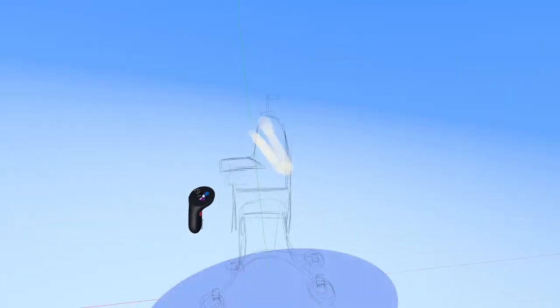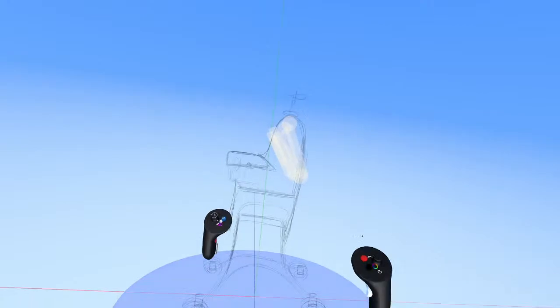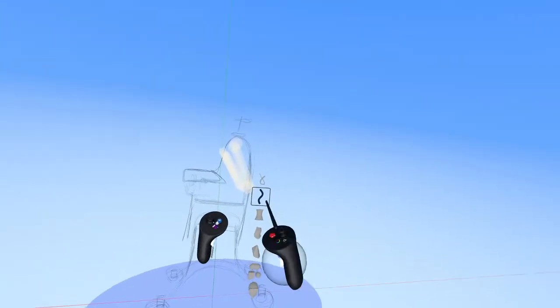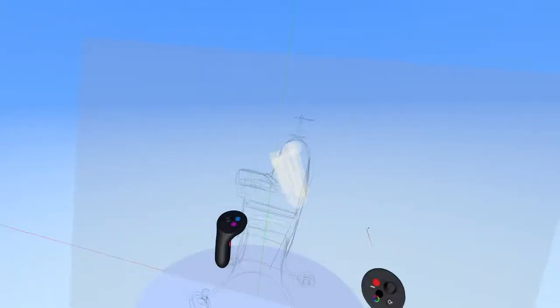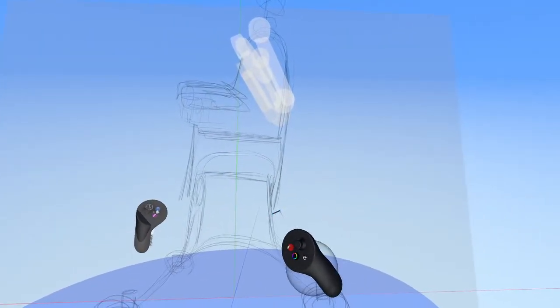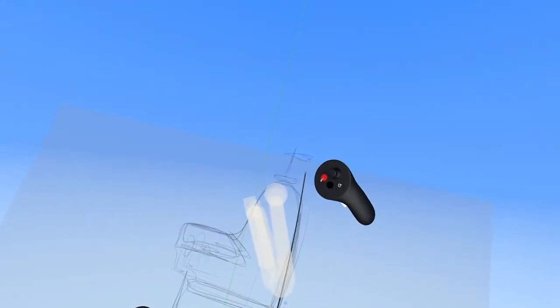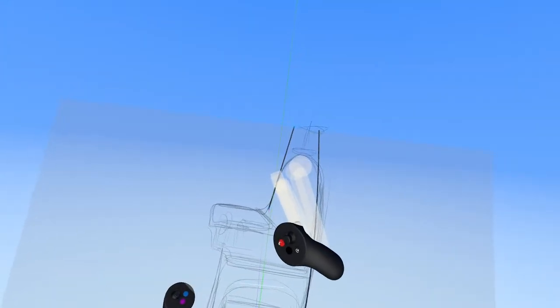All right, great. So now that we have that, I want to hone in the side view or the center line for this robot. So again, go back here, turn on the planar tool. We're going to do what we did earlier and snap it to center line like that. And now what we can do is just click out the lines for this guy. Let's just keep it simple right now like that. Keep the shape very simple, I mean.